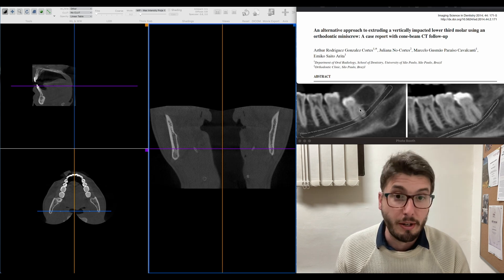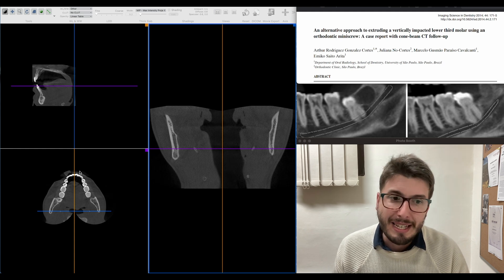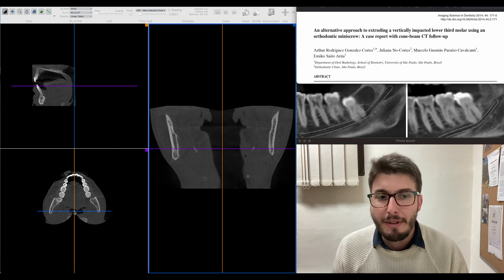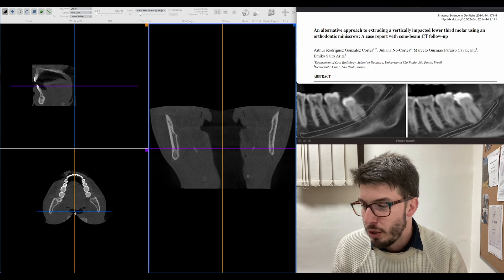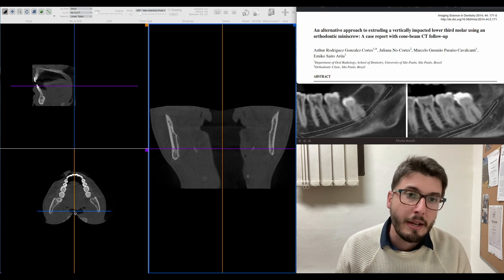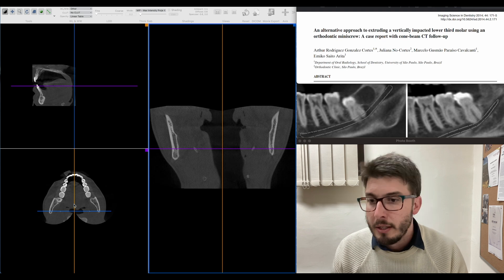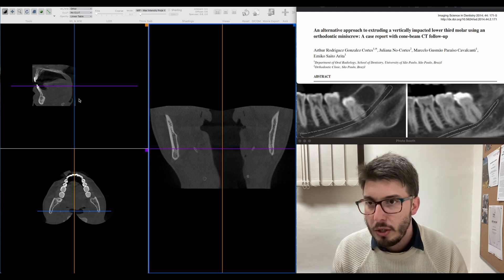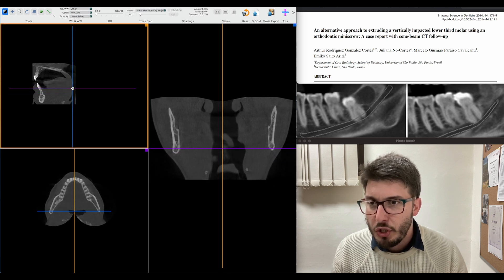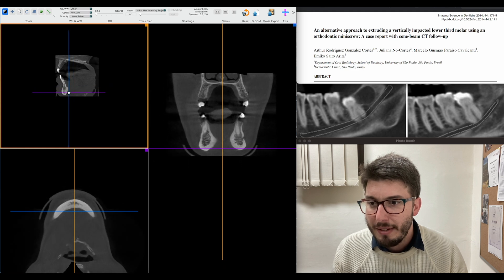Now let's analyze this live case — a lower third molar indicated for extraction with no antagonist, as the upper third molar was already extracted. The tooth is not severely impacted, but we still need CBCT diagnosis to assess the proximity of the roots to the mandibular canal. I'll start by navigating through the axial slices, changing the axis while following what's happening in the axial view.